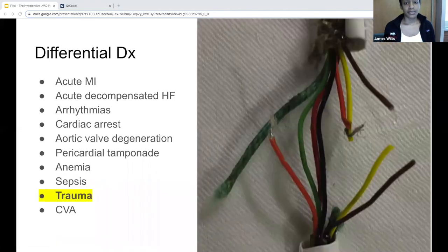Trauma: the cables can be damaged, the cannula or pump could be physically dislodged, and there's percutaneous trauma. Treat and stabilize traumatic injuries. You definitely need CT surgery on board ASAP for any suspected device complications.